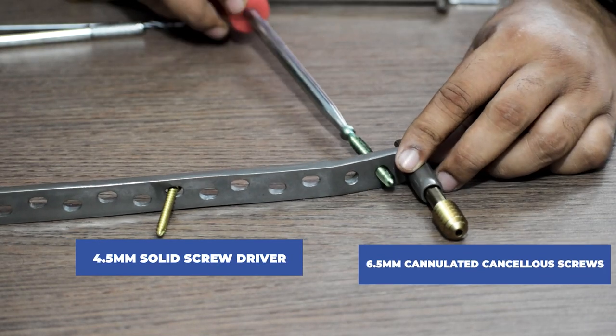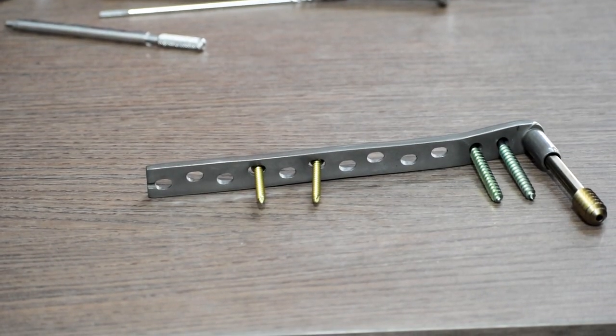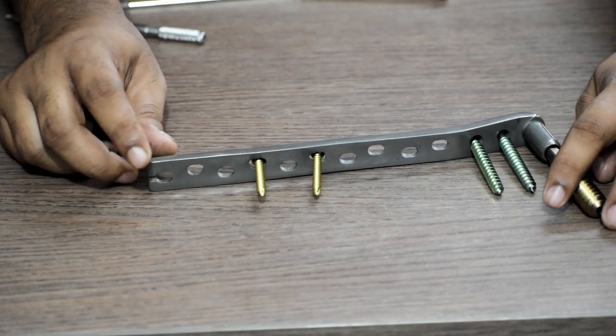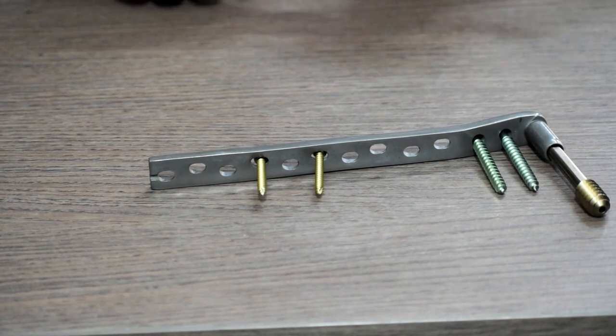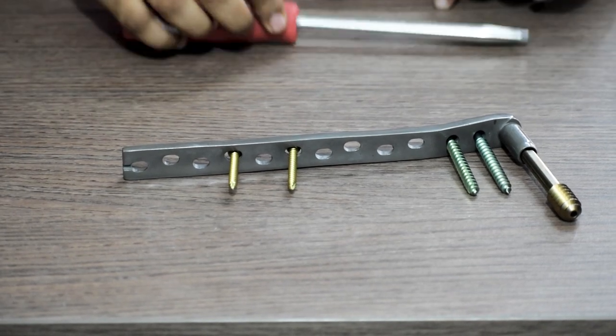Again use a 4.5 mm solid screwdriver to fix the cancellous screw. Then we fix as many screws as the surgeon wants and is required. That's all for the fixation procedure of DCS plate and screw.